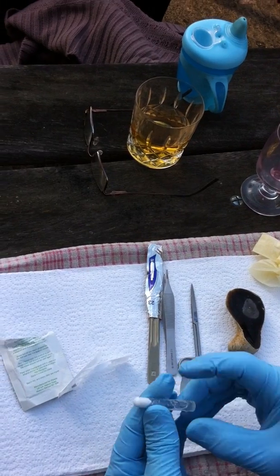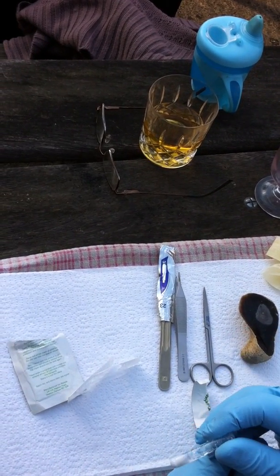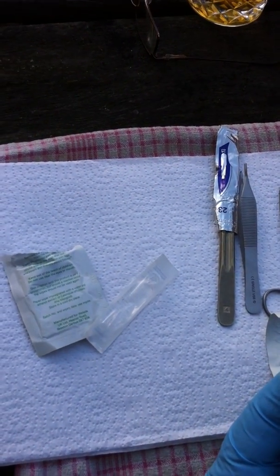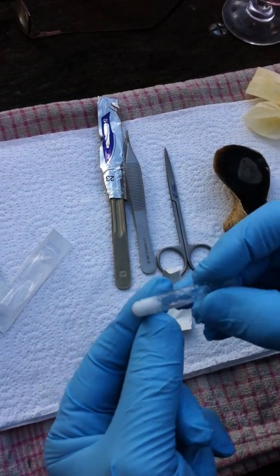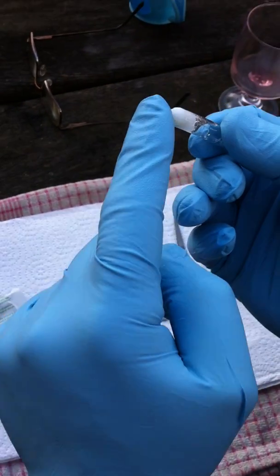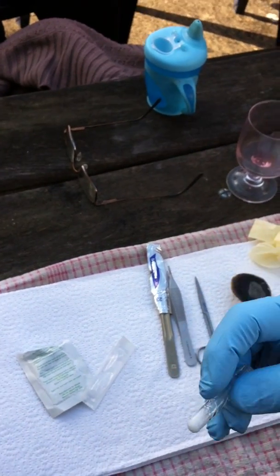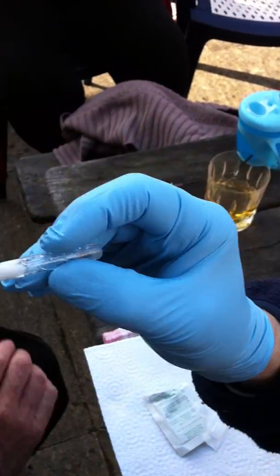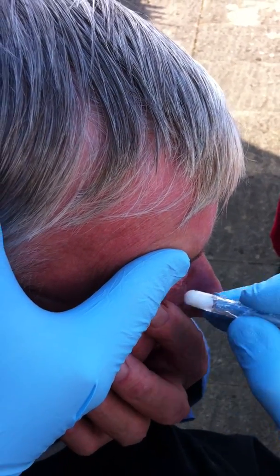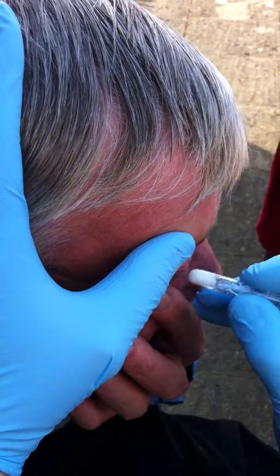Is it not glue? A skin glue? No, no — it isn't. This is a mixture of chlorhexidine and isopropyl alcohol. You break the internal capsule and then the sterile liquid is on the tip. And I'm just going to sterilise around there — we'll use those in theatre. I'm not going to put it in his eye, but we'll just sterilise the papilloma with that. We call it Dermabond. No, no — not Dermabond. I know, but it looks like Dermabond, doesn't it? It does, but it isn't. We call it that on YouTube.